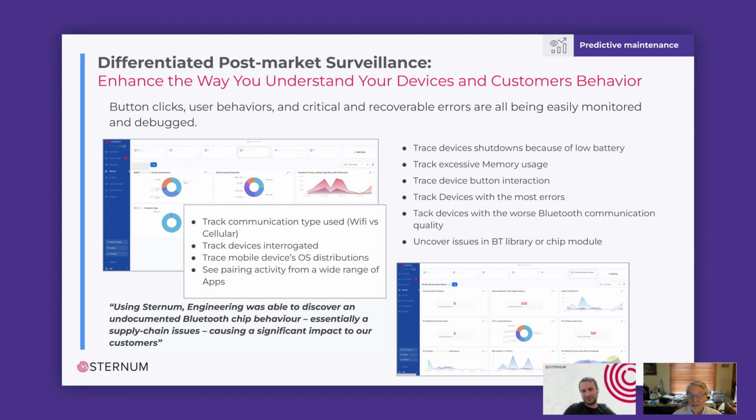We have 6 different functions assigned to that button that have different functions depending on the context of when it's being used. Like, for example, if you want to turn the unit off, you have to press and hold the button for 5 seconds. So we don't want to allow the user to do that while the product is in use during a patient session, though. So what we do is we monitor how often they try and turn the patient connector off versus how often it actually is able to turn itself off based on use conditions. And there's a big disconnect there.